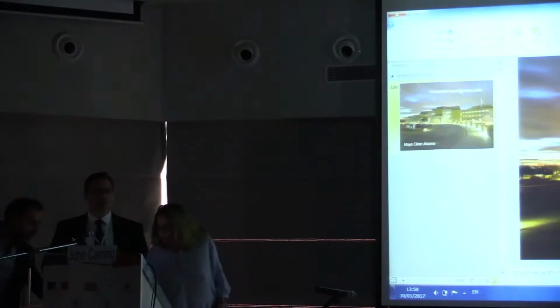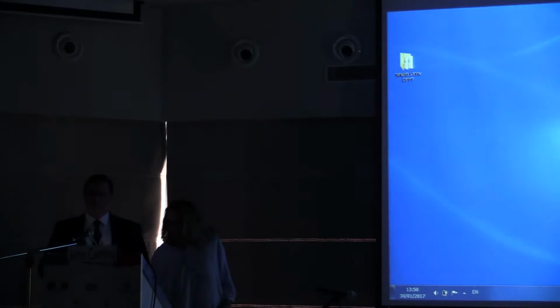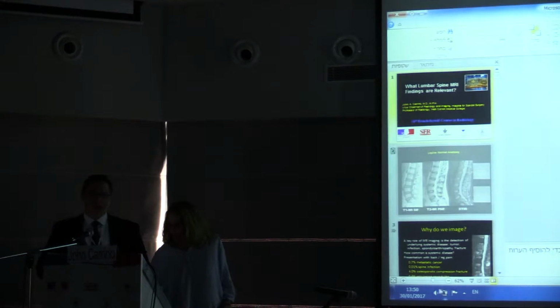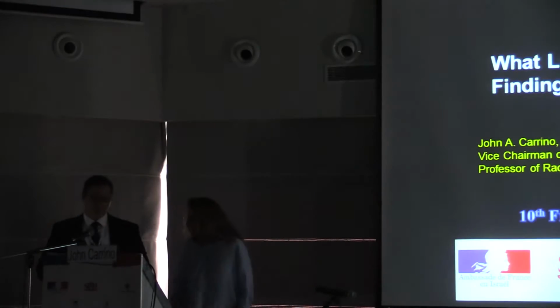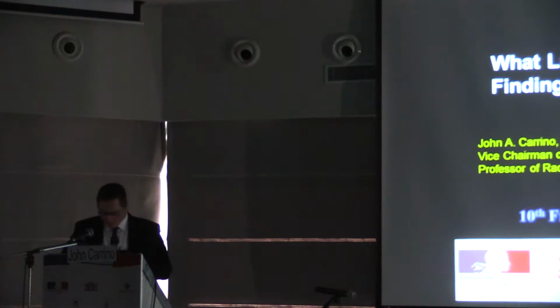Certainly there's a lot of challenges with doing spine imaging, and we'll talk about those. But at a place where I work, where we're very close with the orthopedic surgeons and the spine surgeons, we very frequently add value to our interpretations with spine imaging. And so that's what we're going to talk about for the next 30 minutes.